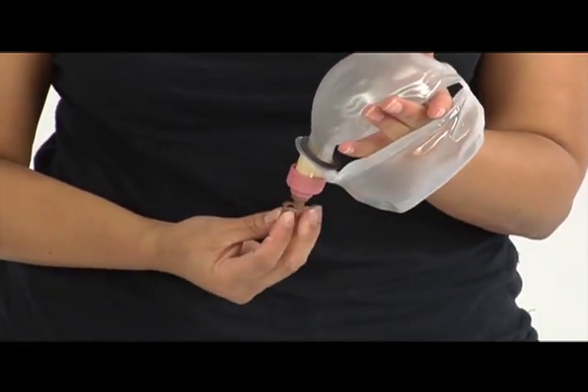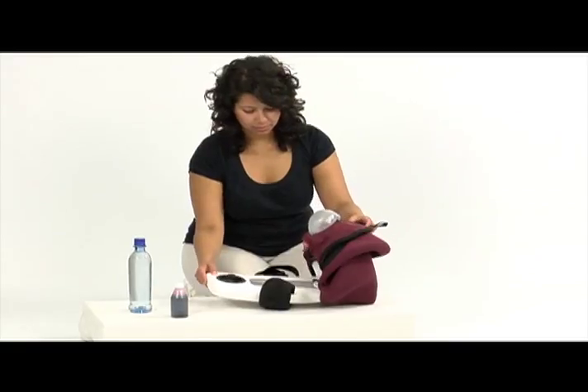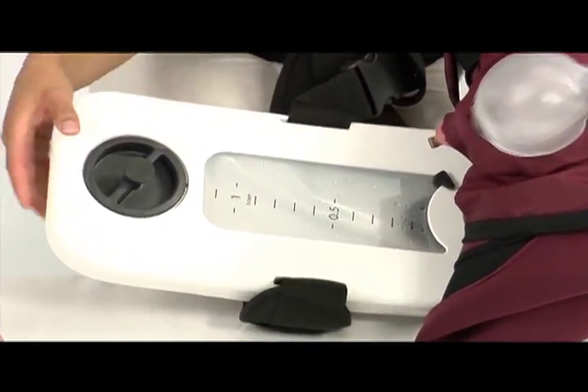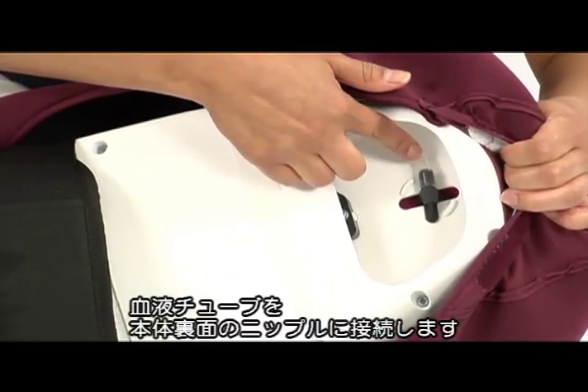Close the air valve. Check that the valve of the blood tank is closed. Ensure that the blood tube is connected to the blood nipple on the backside of the skeleton.